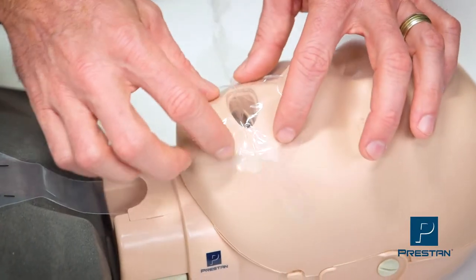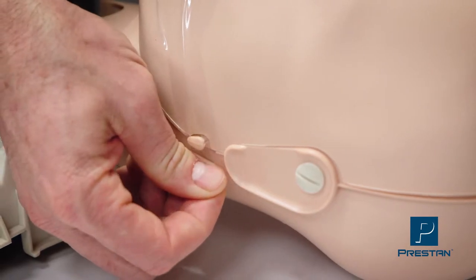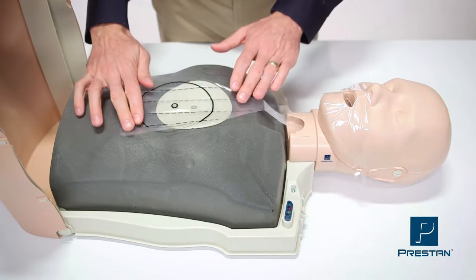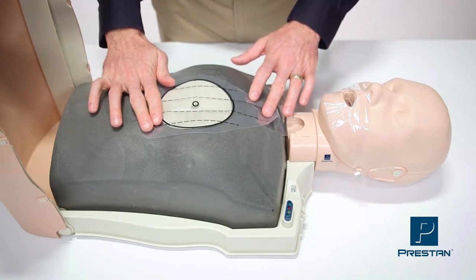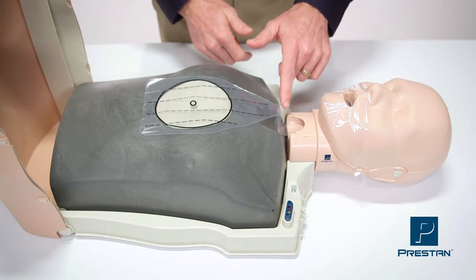Secure the face shield at the ear pins. Lightly tug on the lung bag to help open the mouth hole, and center the lung bag on the chest plate. The neck of the lung bag will have some slack. The small hole in the neck allows air to escape for deflation.